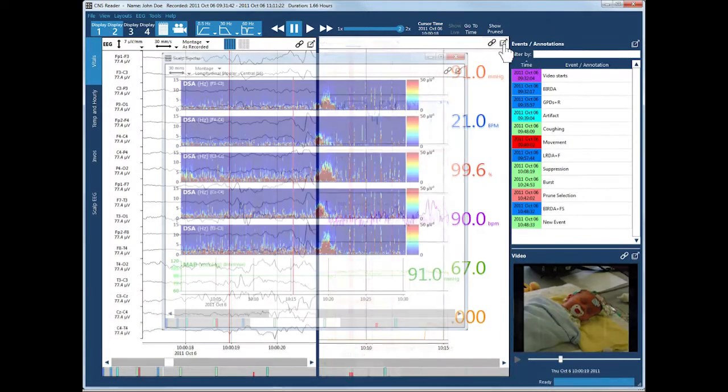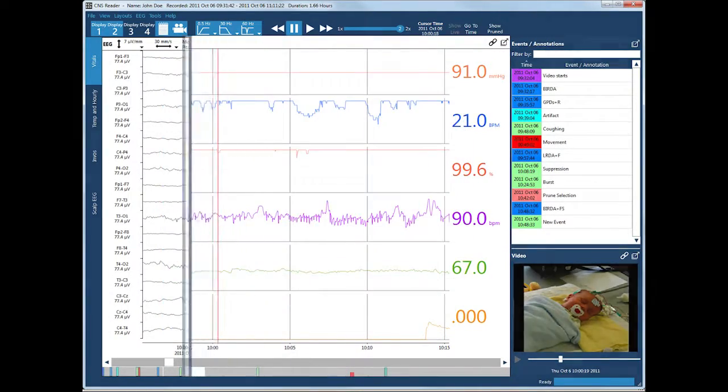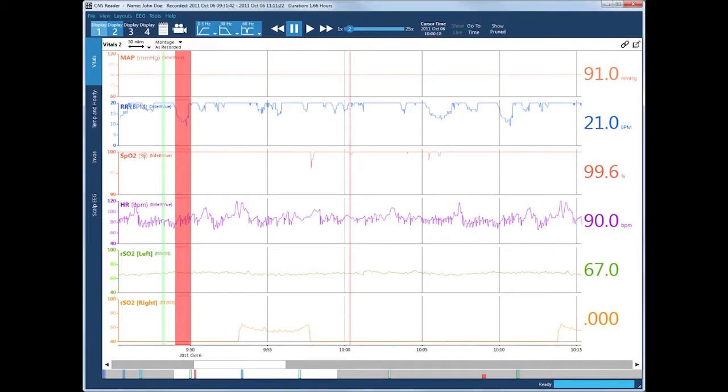Modify the display in a variety of ways to meet your review needs. Review and annotate multimodal data with the same powerful tools.